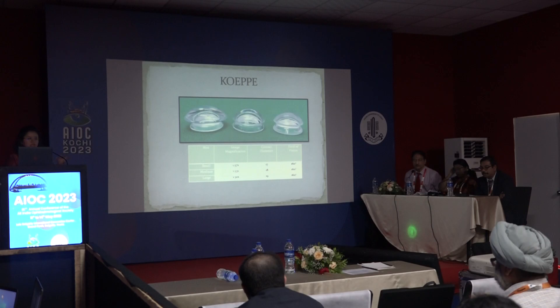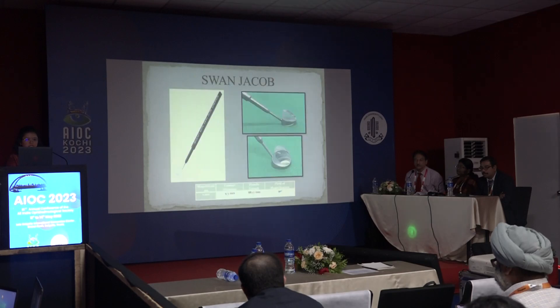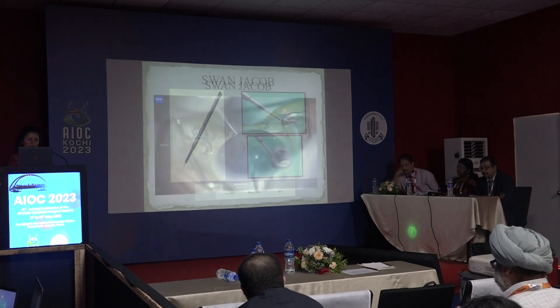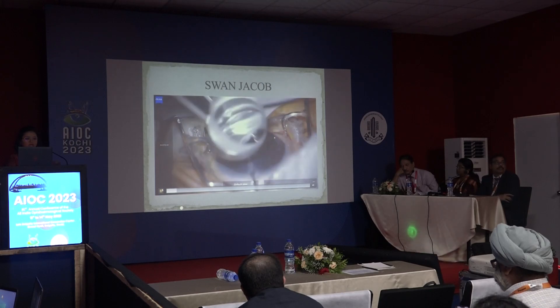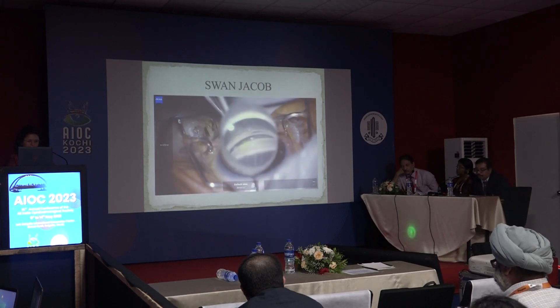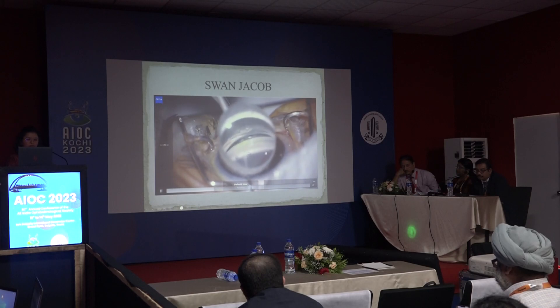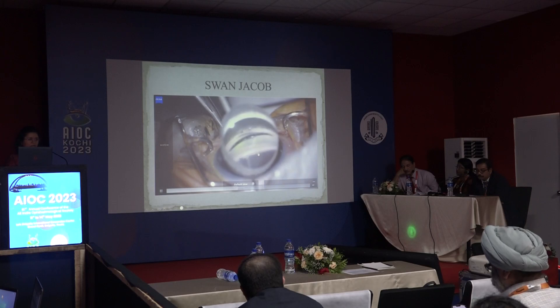The most commonly used is the Koeppe gonio lens, and depending on the size of the eye we have different sizes — Barkan's and lately the Swan-Jacob gonioscope, which is now in vogue because many angle surgeries are being done. This is a short video clip where we are putting a coupling agent and placing the lens. This is a case of primary congenital glaucoma — we can see the high anterior insertion along with a few iris processes and a goniotomy being performed.